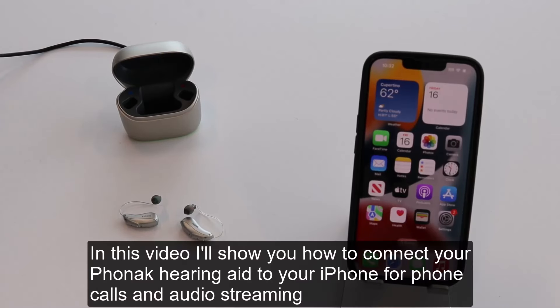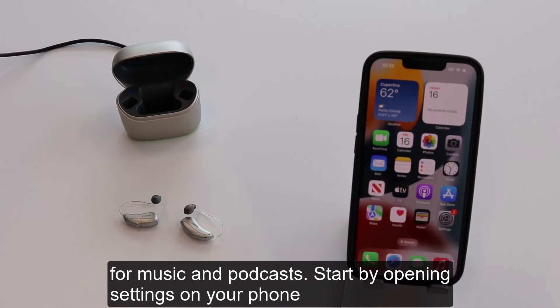In this video, I'll show you how to connect your Phonak hearing aids to your iPhone for phone calls and audio streaming, like for music and podcasts.